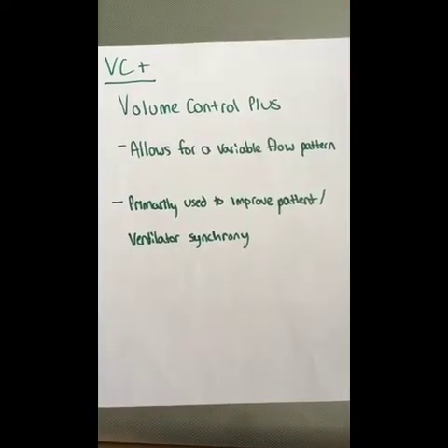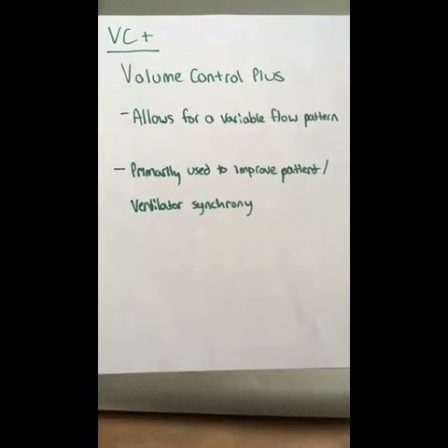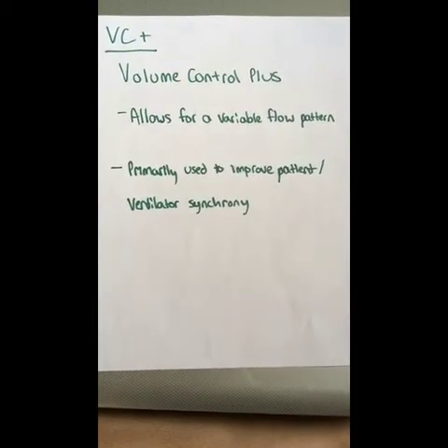The next mode we're going to discuss is called VC+, or Volume Control Plus. The important things to know about VC+ is that it allows for a variable flow pattern, and it is primarily used to improve patient-ventilator synchrony.